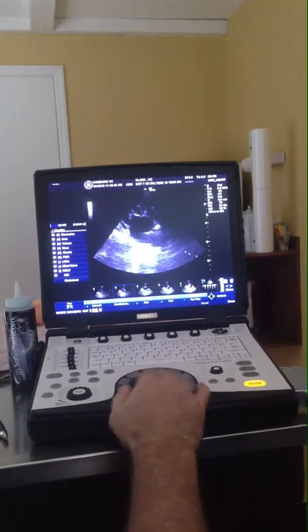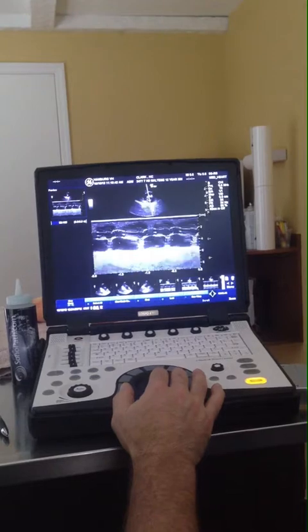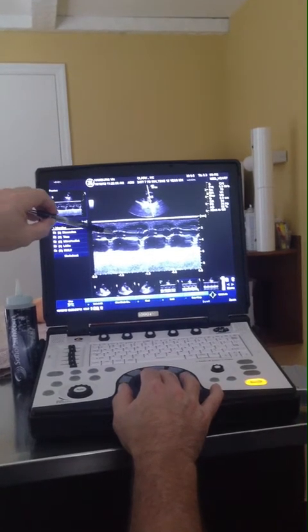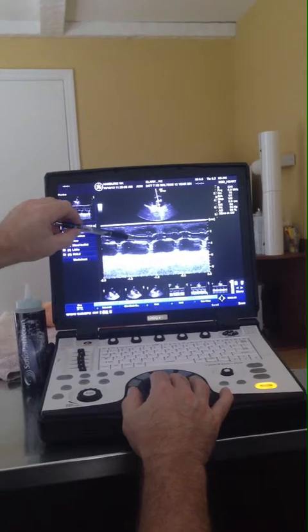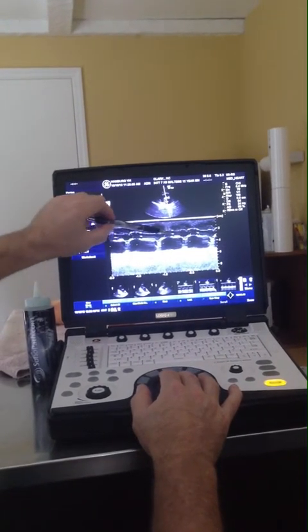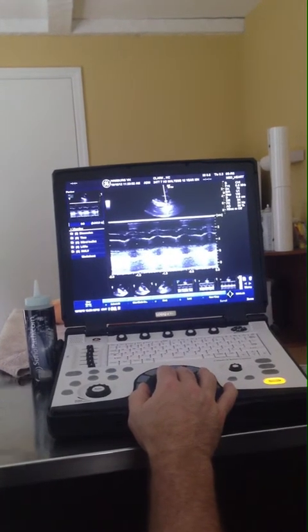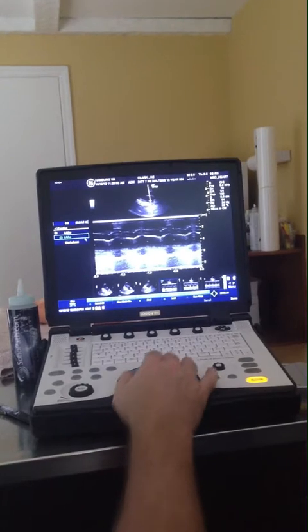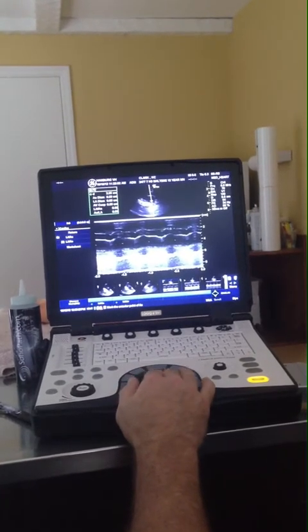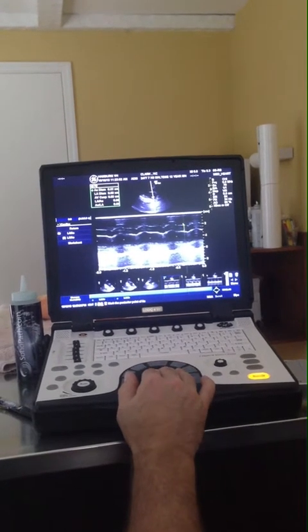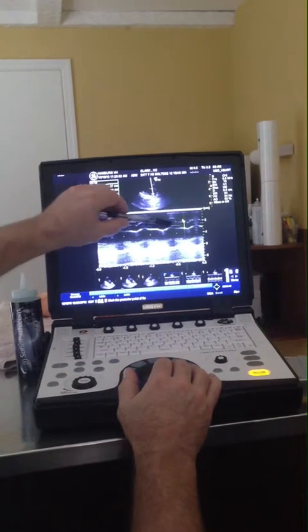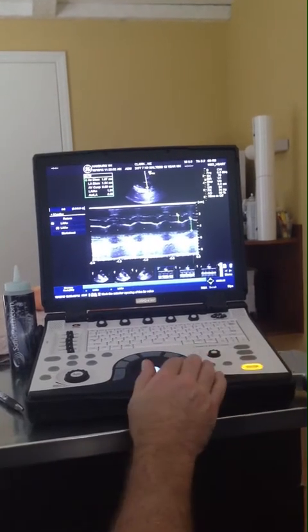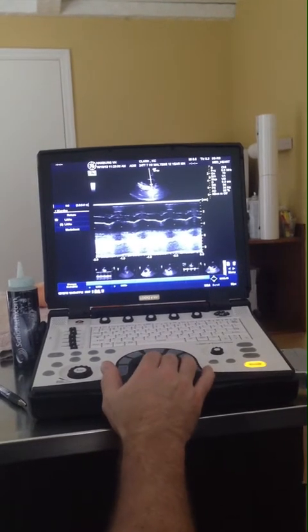Next I'll look for LA to AO — the Jun Boon method. I look at my position here, it's coming through the aortic valve. Looks pretty decent, a little mushy here. I'll take the best one — this is opening and closure of the aortic valve. Leading edge to leading edge at the end of aortic valve closure, and the maximum left atrial size leading edge to leading edge: 1.81, which makes sense because the dog has volume overload. I'll save that one and measure a couple more if available.